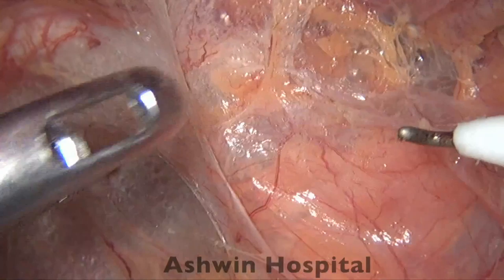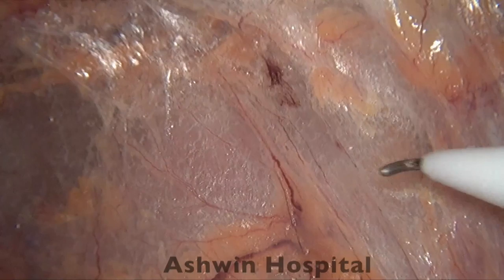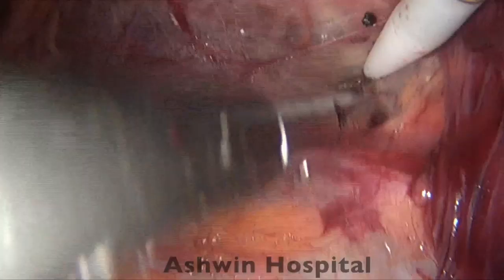that means the major vessels are close by, and we have to be sure that we pull the tissues away and then only dissect. We should not keep it flush with the pelvic sidewall and keep on dissecting. A lot of the times the vein would be collapsed, and we can easily nick the external iliac vein by mistake. So this is the obturator nerve which we are seeing on the left side.